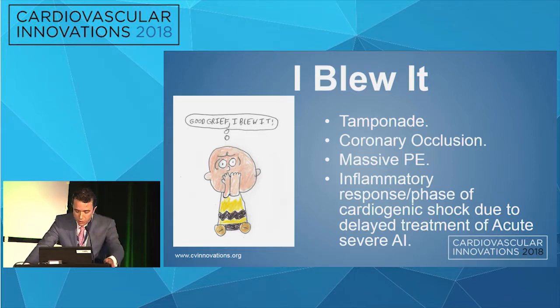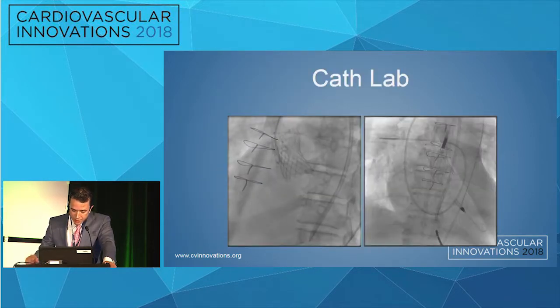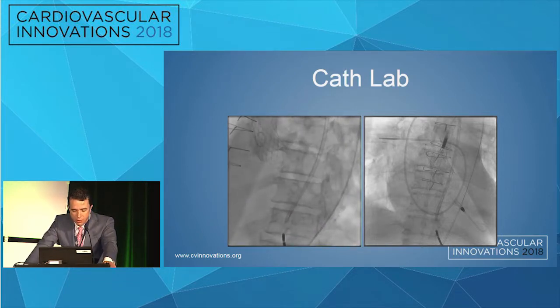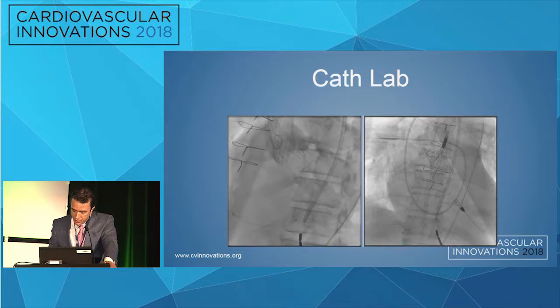This patient waited too long to be treated. And if that's the fourth option, we blew it because they kept this patient too long until he was finally treated. Took him back to the OR, to the cath lab, took the root shot. There was no coronary occlusion, and honestly, my suspicion for coronary occlusion was very low here with his wide sinus. It's extremely unlikely that he would occlude his coronaries, and in fact, there's no occlusion to the coronaries there.